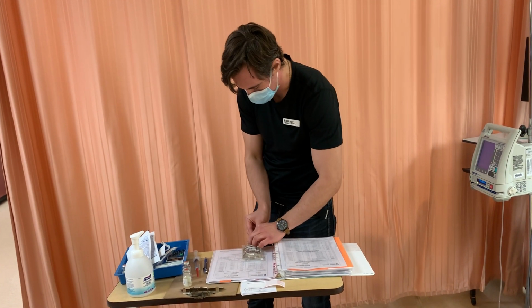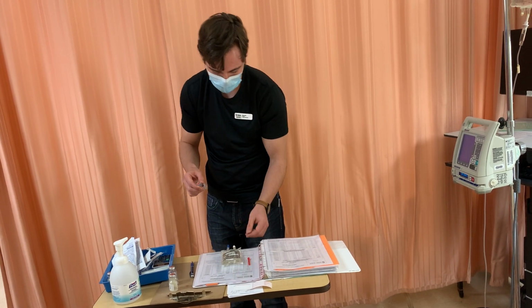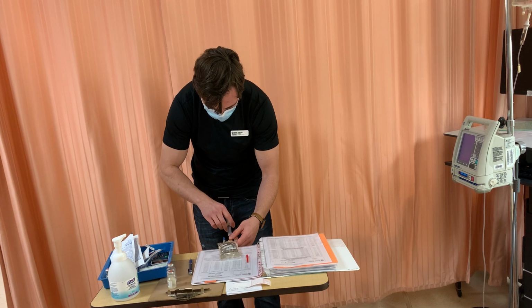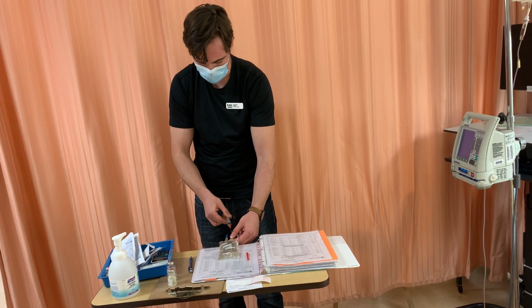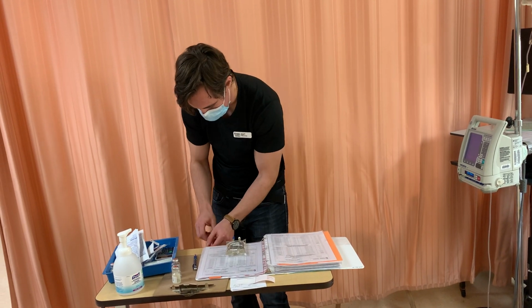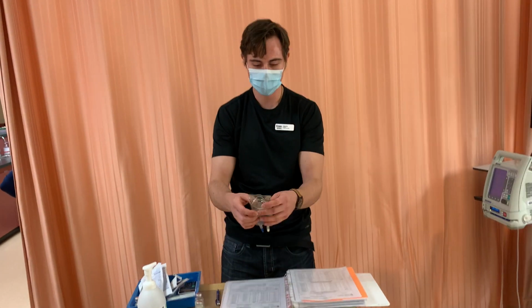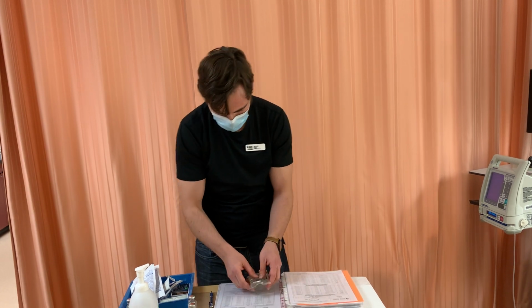I'm going to swab the port for 30 seconds, let it dry for 15. I also check to make sure that our mini bag is not expired. I'm going to dilute our medication in our mini bag, do the scoop method, and this will go in the sharps container. And then I'm going to gently rotate our medication to make sure that it is all dispersed.